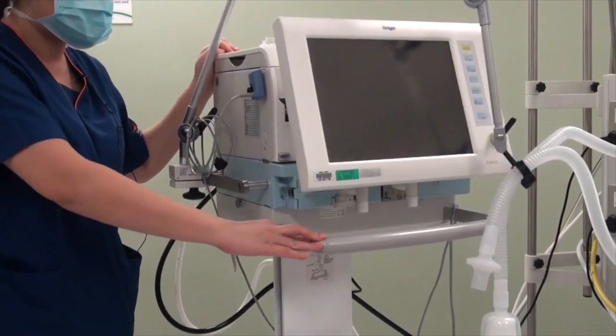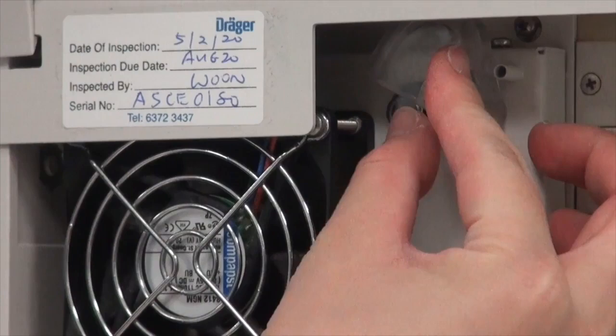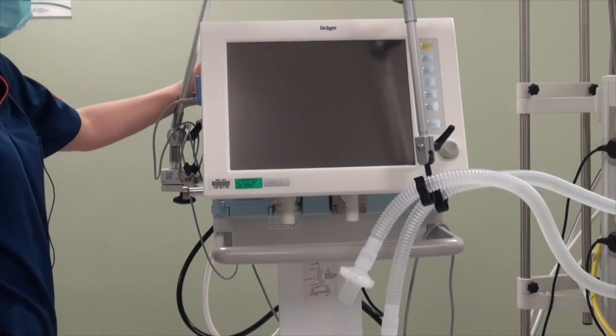First, we need to turn on the ventilator. Turn to the back — the on-off button is located here. Lift up the protective cover and press the button once. The ventilator is now turned on.